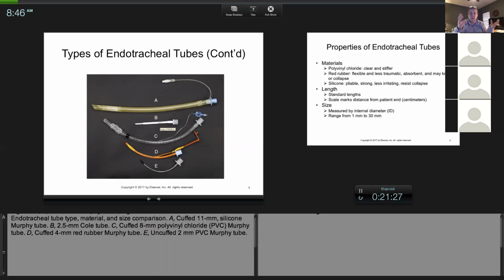I used to keep a tub of water. When I did radiation, I had a tub of hot water in our sink. Of course, it turned cold, but I would put the tubes in there so they at least didn't get dry and gunky. Then at the end of the day, I would dump the water, fill it with hot water and cleanser, and let them sit for 10 minutes while I cleaned and finished up my day, and then I would clean them.